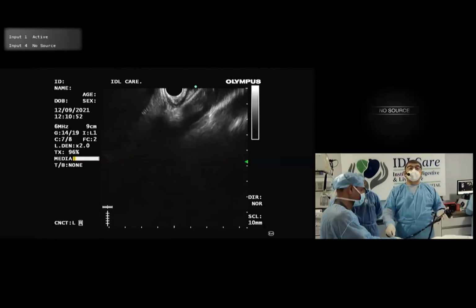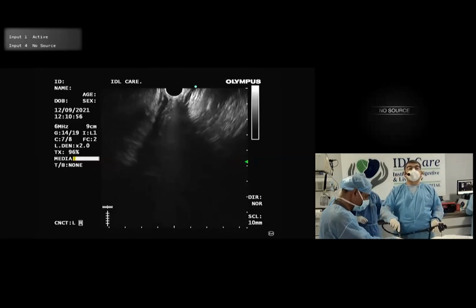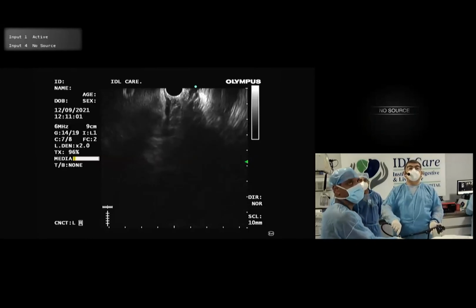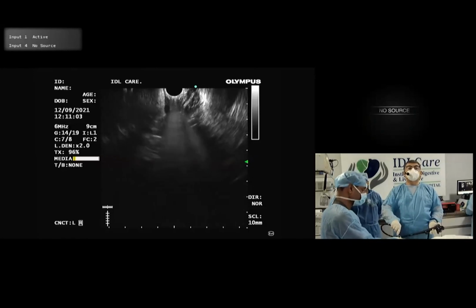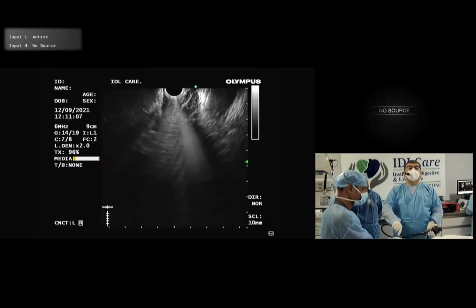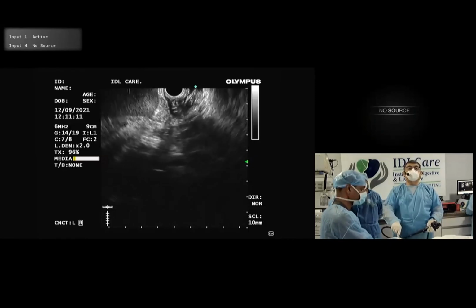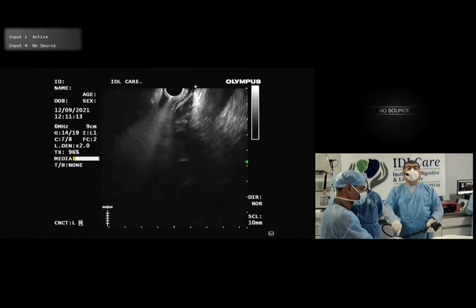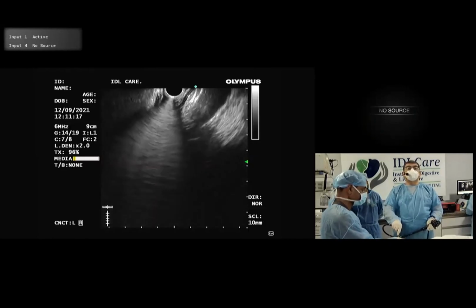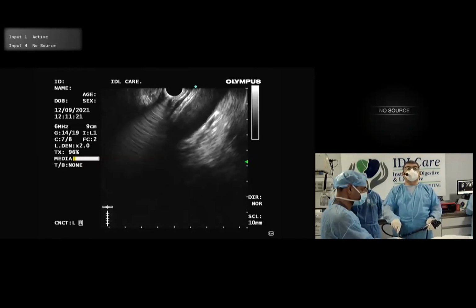See this? I'll show you again. This is the stomach. Come back. You can see the diaphragm here. You can see the liver on one side and aorta on the other side. And you can examine the GE junction really, really well. See this? This is the GE junction. Examine it for any small lesions, some small veins. So like this, quickly evaluate the mediastinum also.